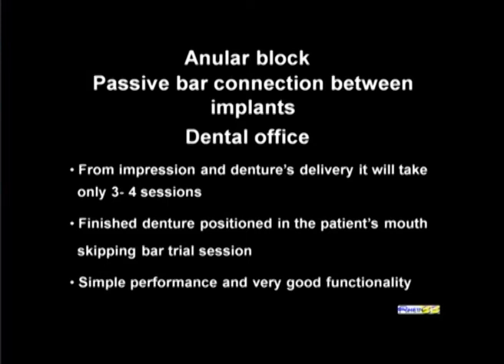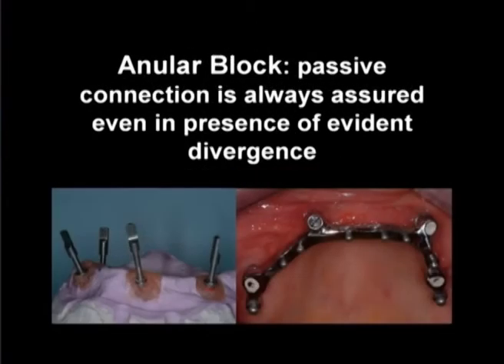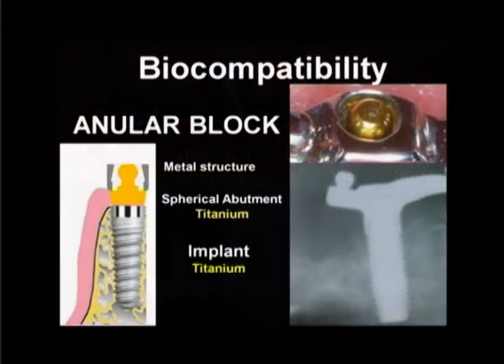With these procedures, we need to point out the fact that besides the many practical advantages they provide, they also dramatically reduce stress and time-wasting visits by the patients to dental offices or trials of temporary dentures and versions of the metallic structures. In fact, no intermediate setups are necessary after trial of wax teeth bite in the mouth, since metal structures are built up immediately and the denture is finished, exactly like in the case illustrated. This technique always allows creation of passive connection bar retained dentures, even in very complicated scenarios, which otherwise would only be resolved through complex and difficult solutions.